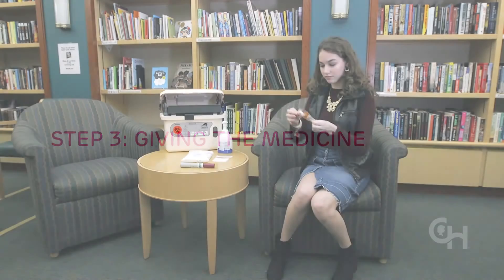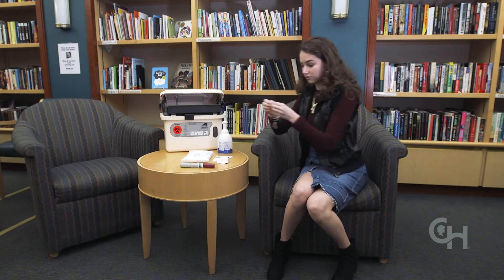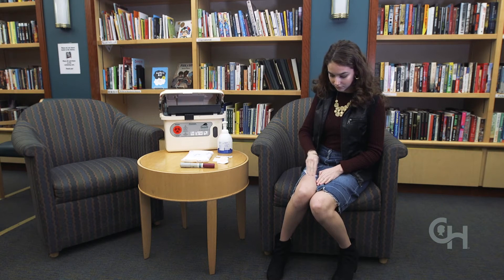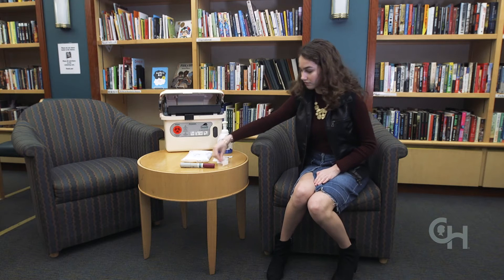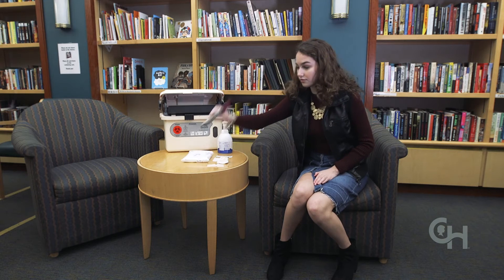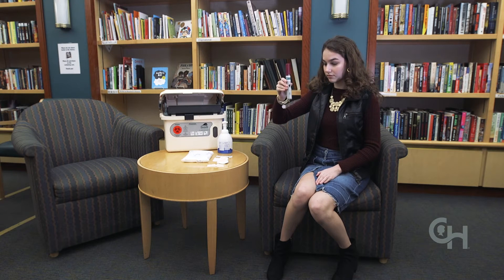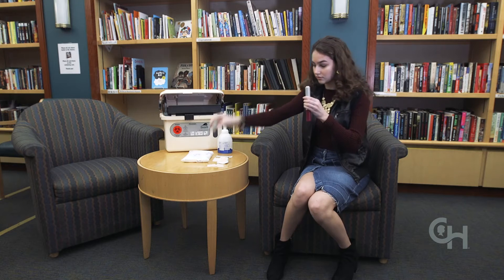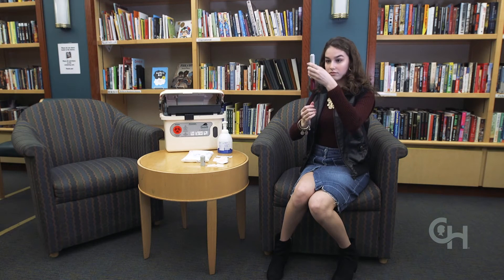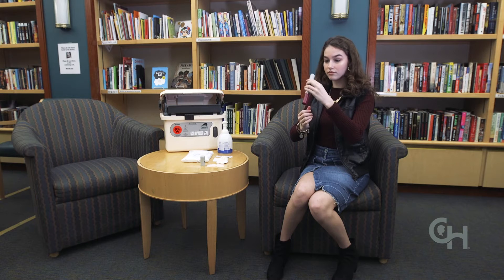The next step is giving the medicine. First, wipe the site you choose with alcohol and let it dry. Hold the middle of the pen with one hand with the gray cap pointing up. With your other hand, pull the gray cap straight off and make sure the small gray needle cover has come off with the gray cap. Do not touch the needle with your fingers or let the needle touch anything.